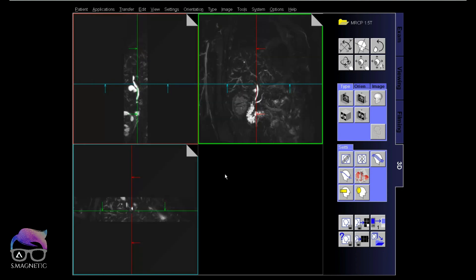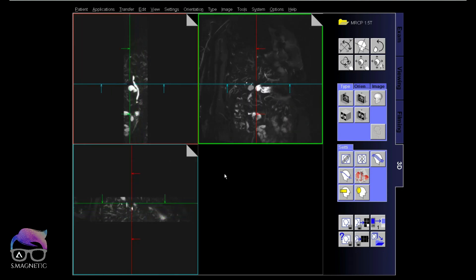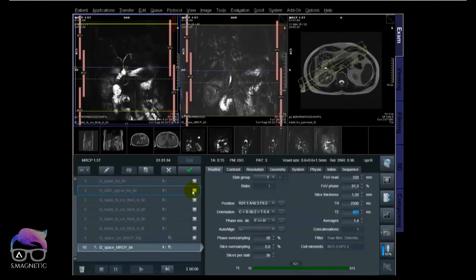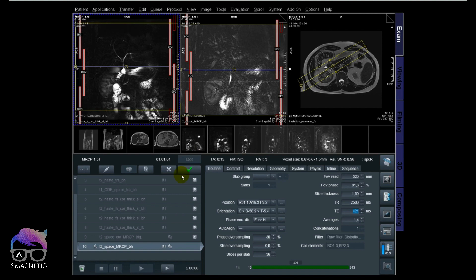In the end, we should rely on native images and not on the MIPs. MIPs are great to look at, but native images are what you should base your assessment on.